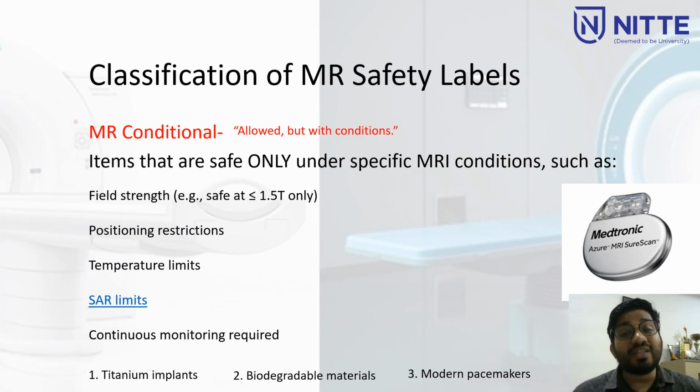Also the heart specialist gives approval. Even though the MR mode is on, 6 weeks are completed, and we are preferring 1.5 T, even though all these criteria are fulfilled, we have to get the approval from the specialist, the heart specialist, to do this particular investigation with MRI. Also monitoring is done continuously. ECG and SpO2 should be continuously monitored during the investigation.